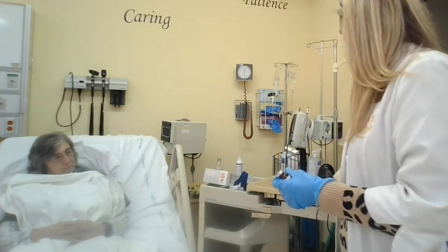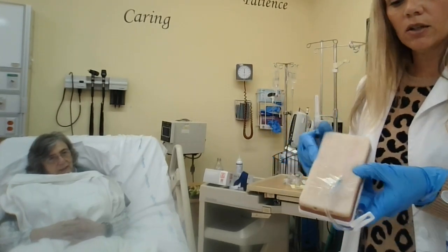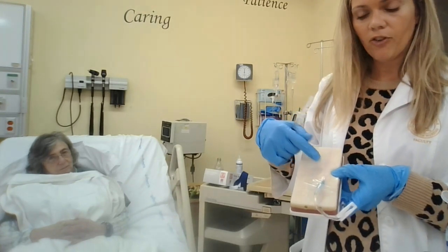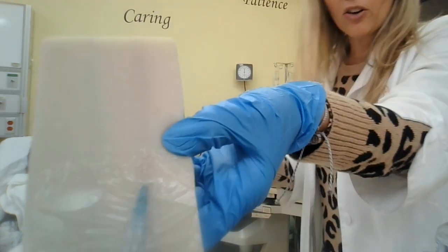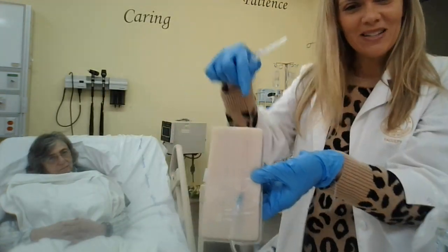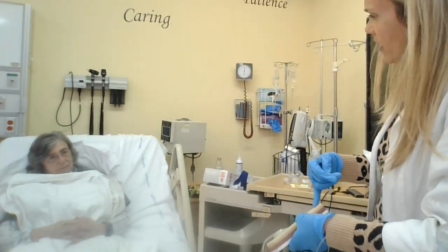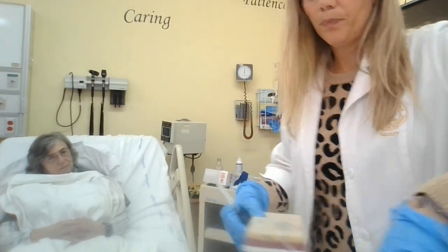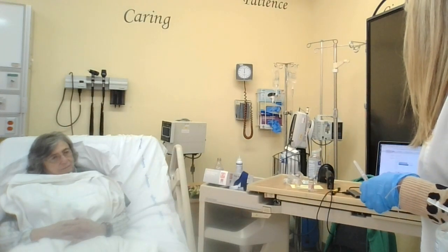Now, since we're giving this in the patient's IV, another critical assessment for you to do is to check that IV site. So we'll check to see if it's patent by flushing it first, but you also want to use your nursing school skills. You can see on my model here, it's a little red. If it was, I probably wouldn't use that line. I think that's just meant so we can see the vein. But you can ask your patient, are you having any pain at all there? Okay, and I don't see any redness or swelling. So that looks great. And we're going to go ahead and scan our Lasix.